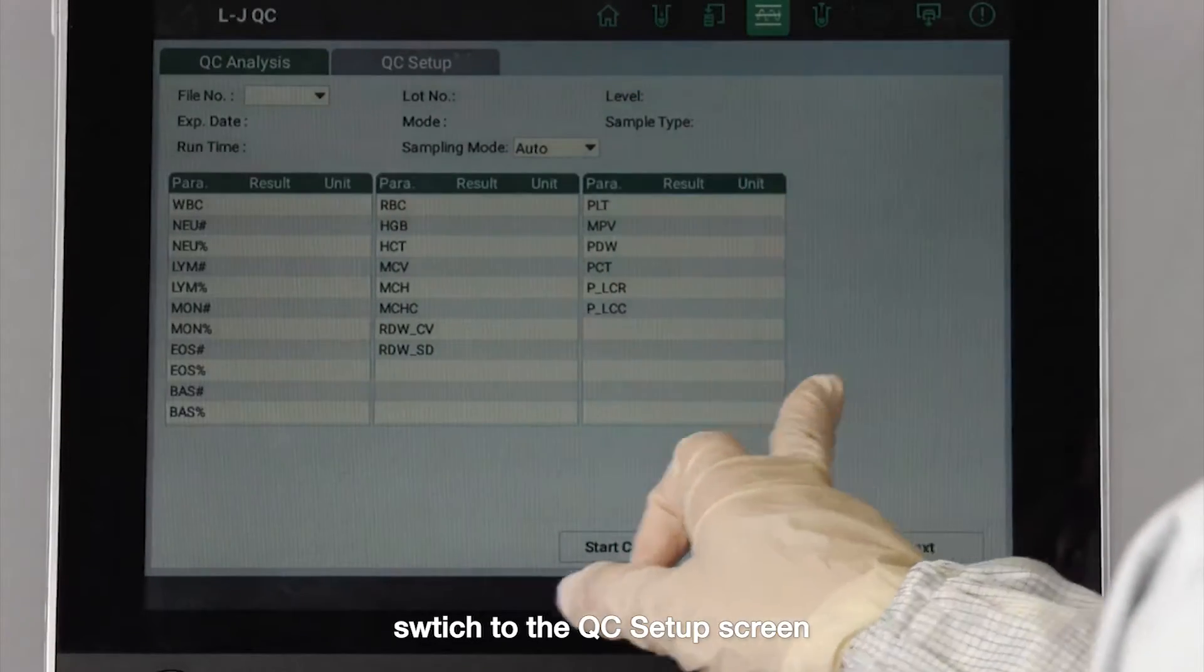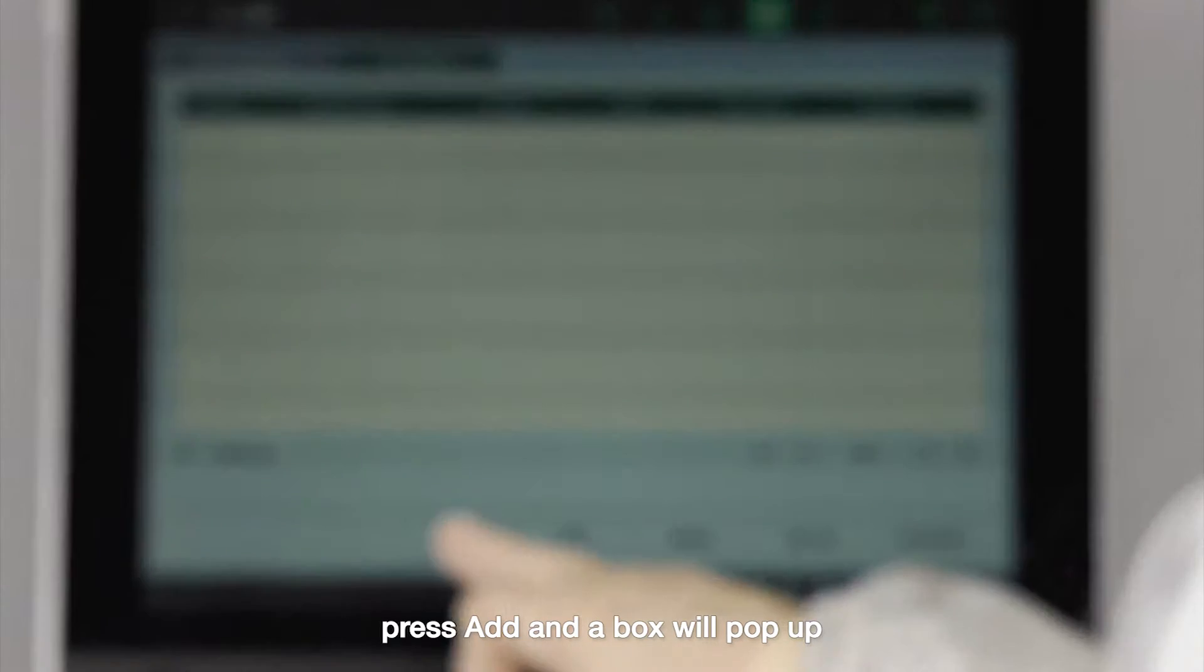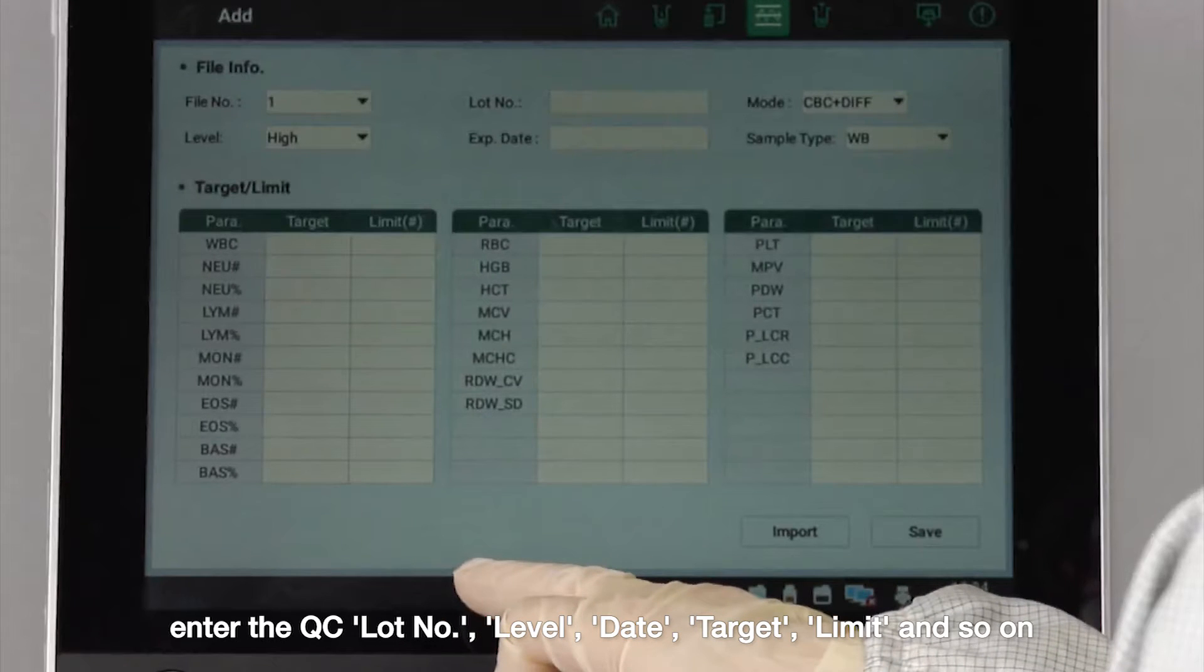Switch to the quality control setup screen. Press add and a box will pop up. Enter the quality control lot number, level, date, target, limit and so on.